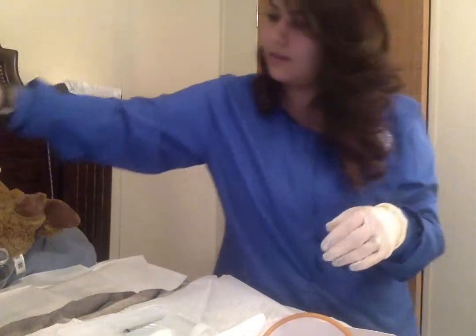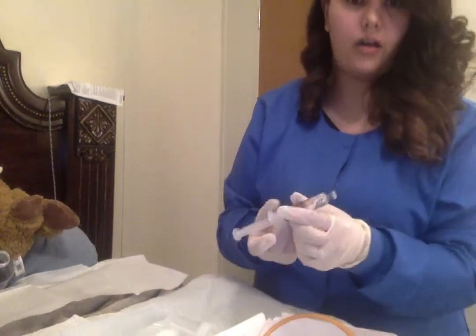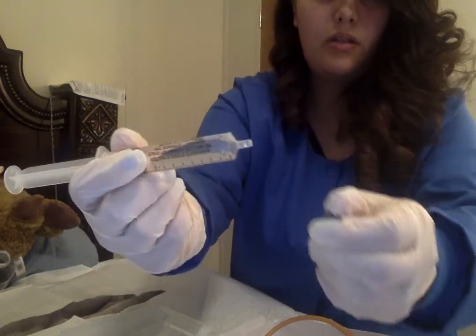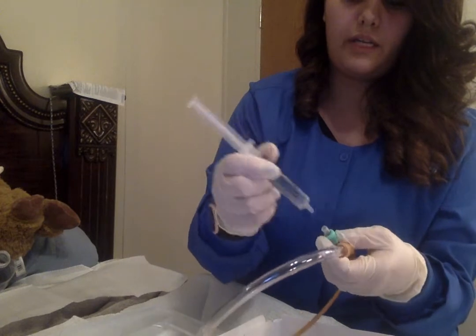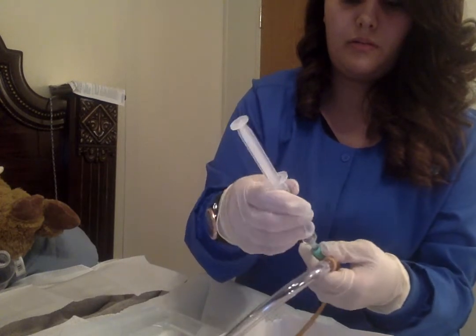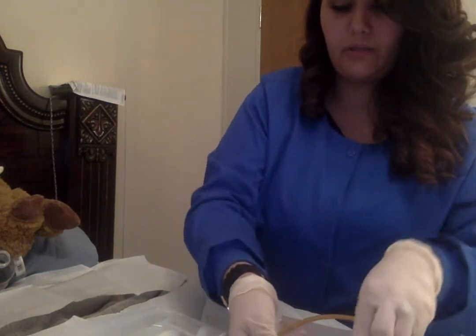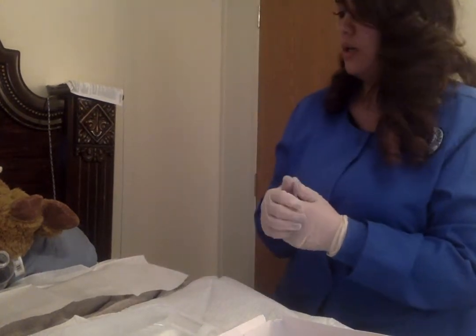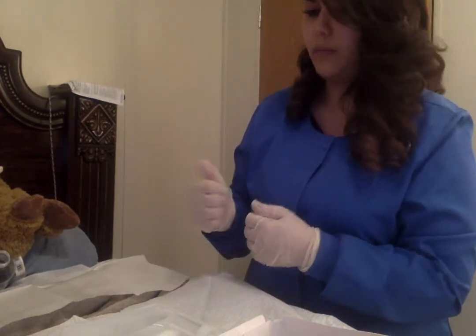Throw this away. We are going to take this off. We're going to uncap this. And we are going to plug it in to our catheter. Okay, make sure that's still in there. Next, we are going to get ready to put our Foley catheter into our patient.